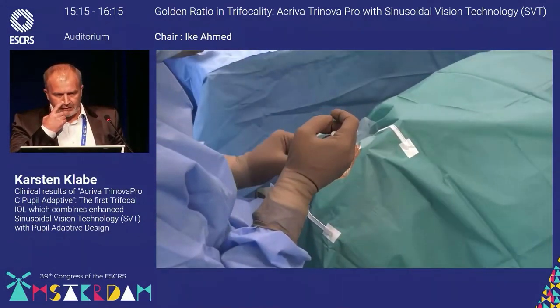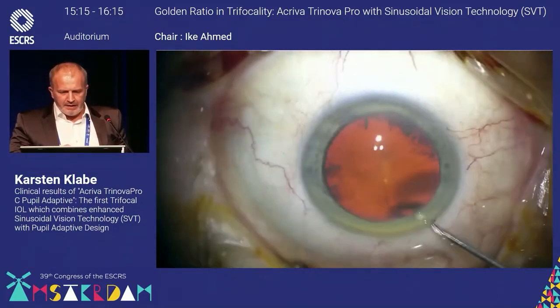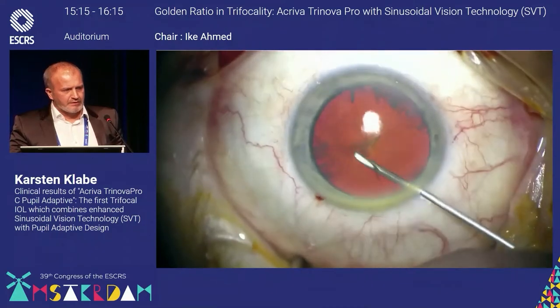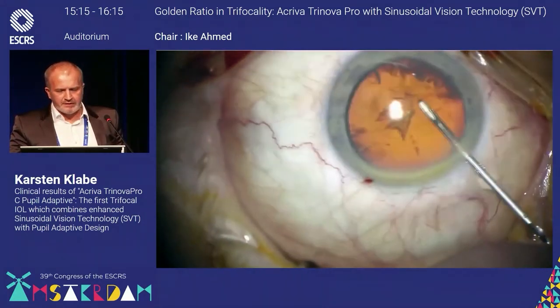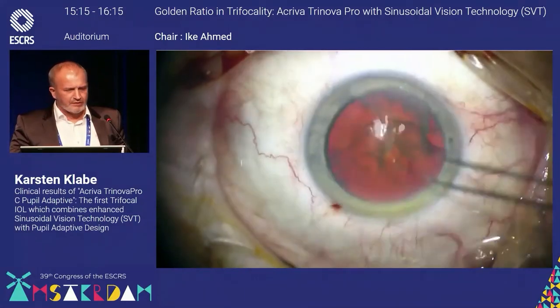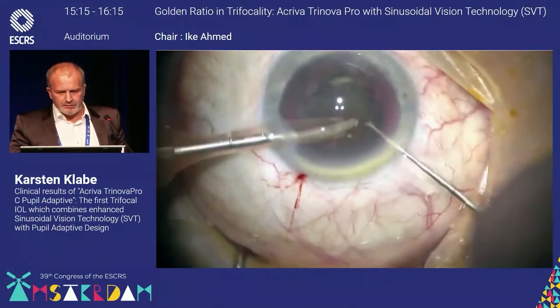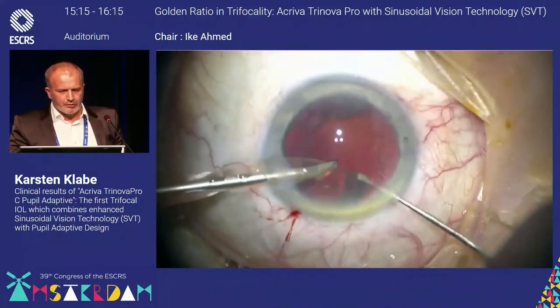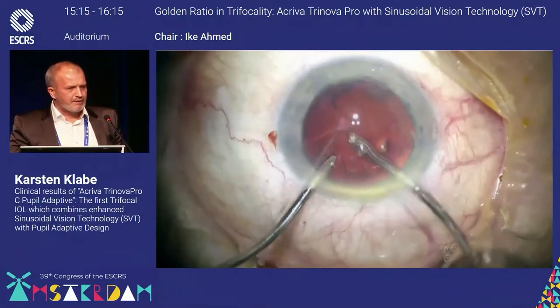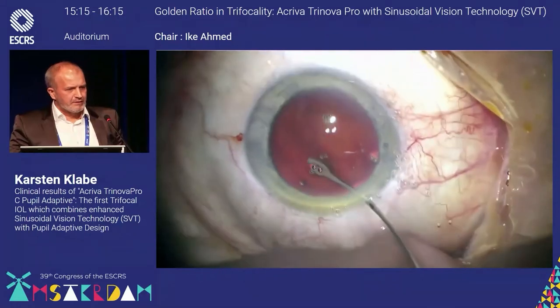So here we go. First surgery on the left eye. Remember, the eye did not have so high astigmatism. The patient wishes a standard procedure, so we don't use femtolaser-assisted cataract surgery, which I would prefer, especially with these types of lenses, because of the possible better centration, preventing tilt, and so on. It's not a really rock-hard cataract. We are able to manage it easily. And then after polishing the capsule, I love to first implant a capsule tension ring to hold the capsule open and to prevent shrinking after surgery.